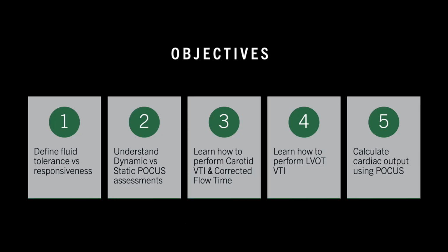By the end of this session, I hope you'll be more able to clearly distinguish fluid tolerance versus responsiveness, and we'll cover dynamic versus static assessments, learn how to perform Carotid VTI, LVOT VTI, and corrected flow time. And as a bonus, we're also going to learn how we can measure cardiac output with these fancy new calculations that we're going to learn. And ultimately, our goal here today is to understand how this all integrates into improving care of our critical care patients and improving hemodynamic decision-making.